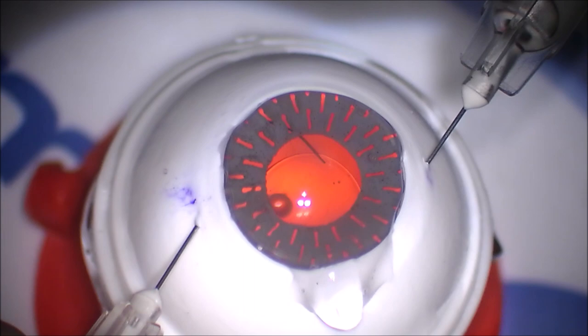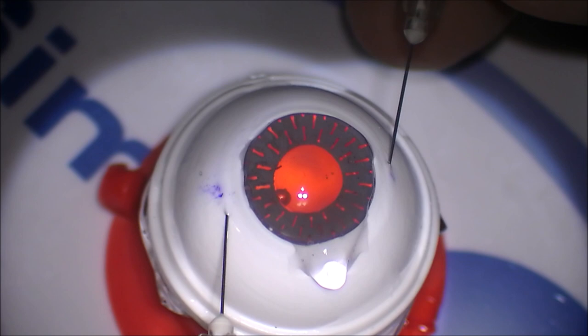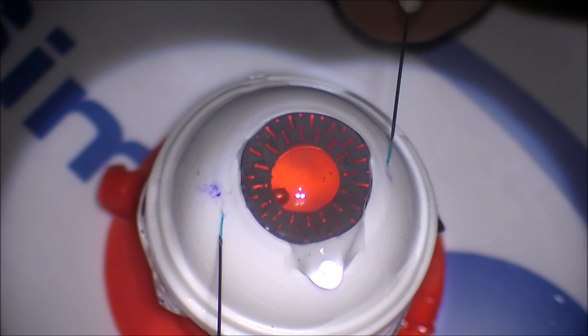And as you know, I like to bend my needles. What would happen if the needle swivels? And of course, you're having to deal with the anatomy of the eye, the nose might be in the way, and so forth. And so I do have that concern as well, leaving the two needles free in the eye when you're placing it with this Guter Yamani double needle stabilizer.